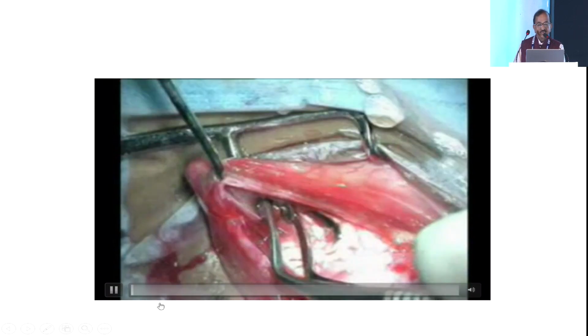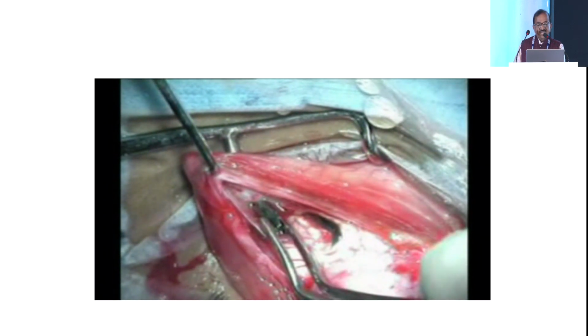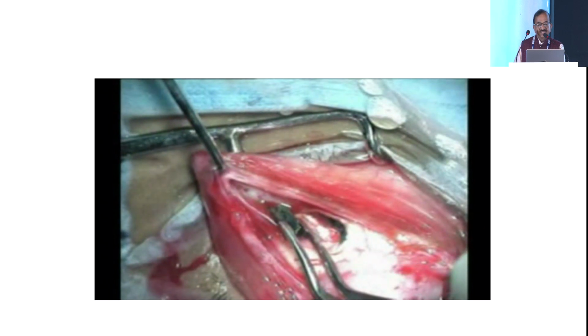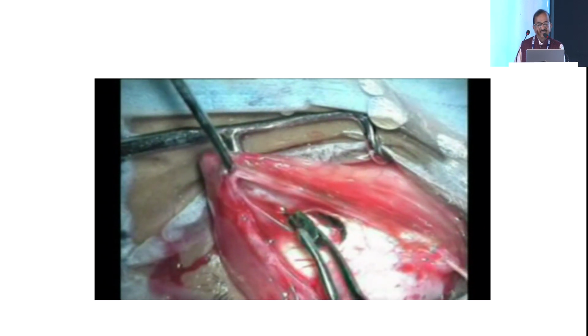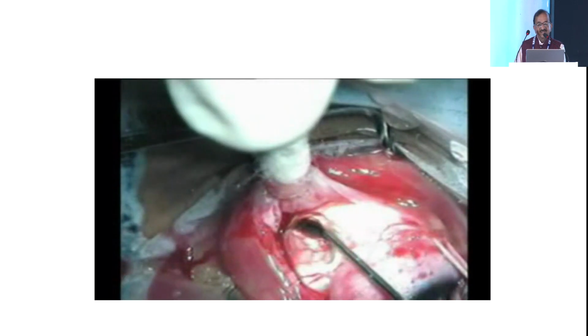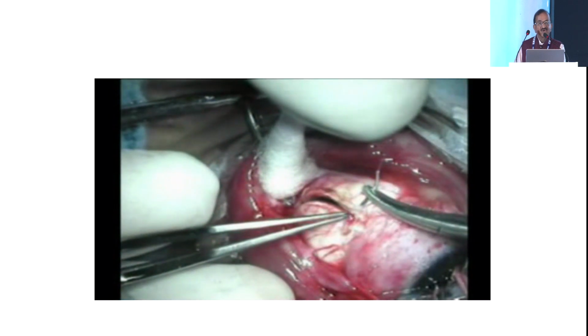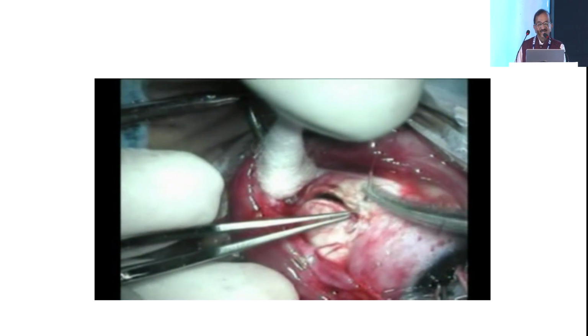Yeah, this is a patient who had a double tear. Actually, it had grazed the sclera and then again twice at the back of the sclera. This was the foreign body which was removed, and then we switched. These were some of the cases that I did in the earlier part of my career. Now I would rather suture up the proximal wound and then go after the foreign body. But in those days we were energetically running after the foreign body.